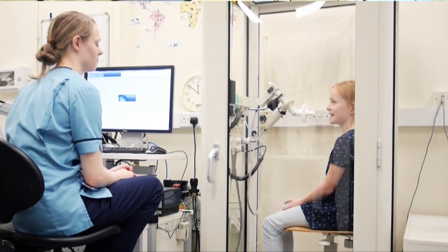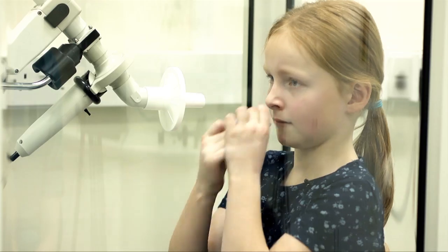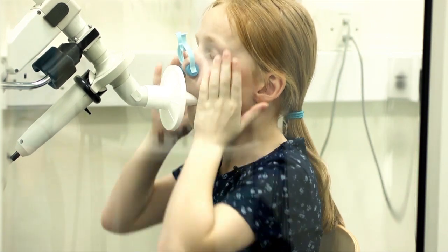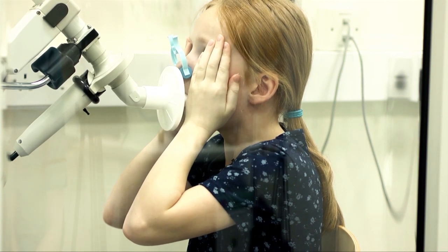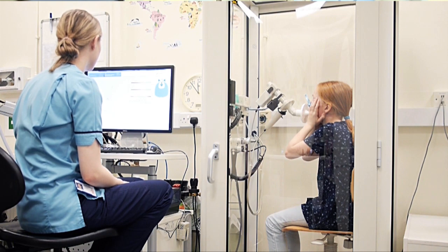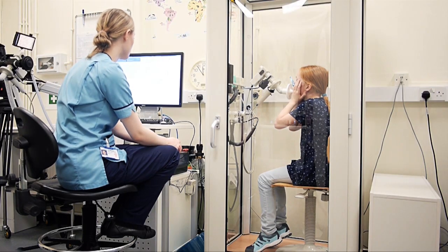Right Susan, that's us ready to start. If you want to put your nose pegs on your nose and put your lips and teeth round that mouthpiece for me. Sit up nice and tall and hands up onto your cheeks. We're just going to breathe nice and normally in and out to start off with. So I'm going to close the shutter now — breathe in, out, in, out and then blow all the way out.